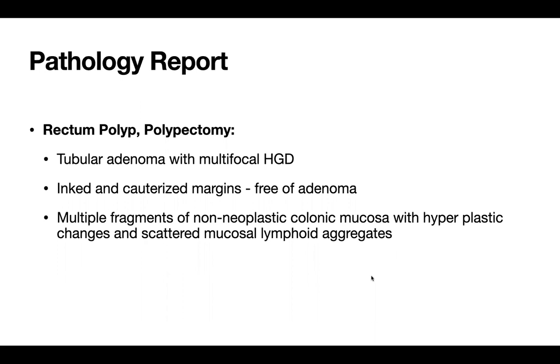I don't put them in separate fragments, separate containers. The only time I put them in a separate container is when I resect a large sessile component surrounded by a flat area. The large sessile component, I put in a separate bottle to make sure that they put their attention to that large sessile component for advanced neoplastic changes.